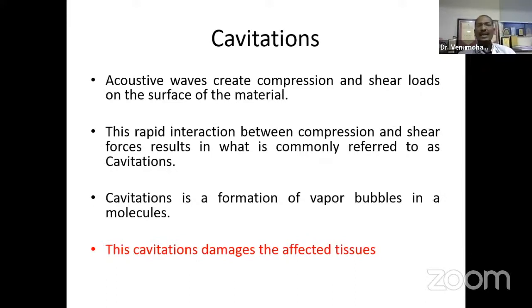Now, coming to cavitation, whenever there is an acoustic wave, it creates compression and shear loads on the surface of the material it is delivered to. There is a rapid interaction between the compression and shear forces, which will result in cavitation. Once cavitation is formed, we see small vapor bubbles within the tissue. This cavitation has the potential to damage the tissue.